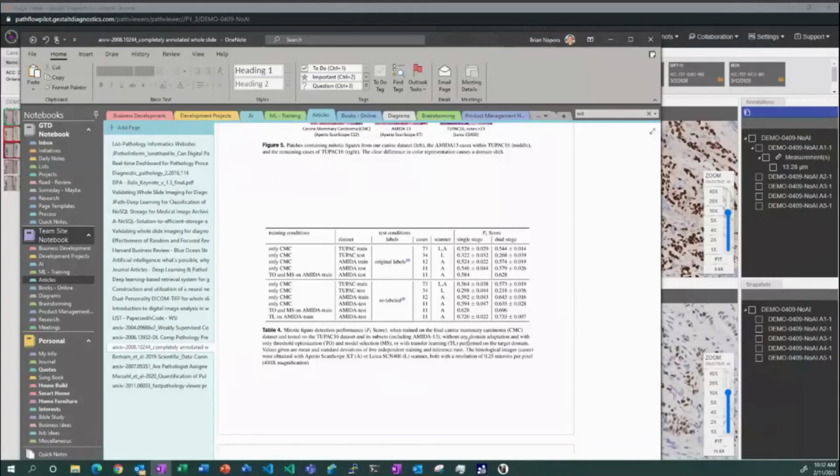So it might be of interest for you once we figure out all the mechanics to be able to have that pipeline in work.